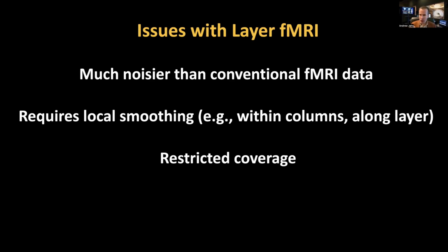And if you get to a very high resolution, it tends to be dominated by thermal noise and random noise from the scanner. And you also have to worry still about things like motion. So how are we going to account for that? We'll talk about that later on in the talk.